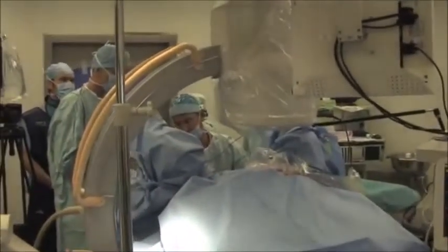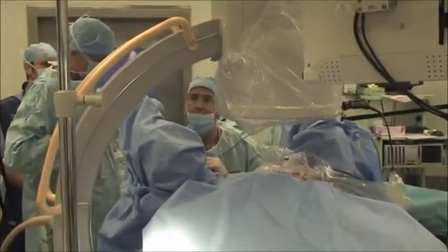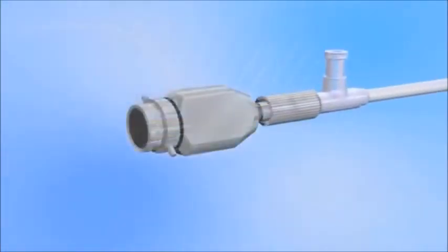Upon completion of the procedure, the light connector of the Poliscope is removed from the light adapter and the fiber optic is removed from the catheter and stored in its dispenser so that it's ready for future use.